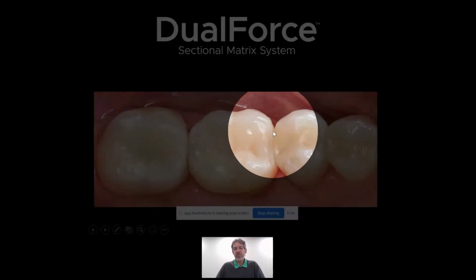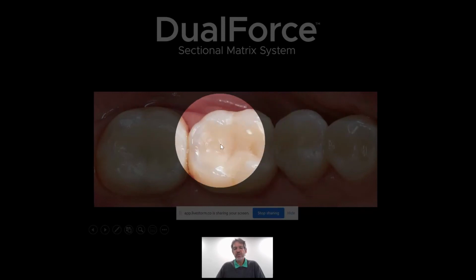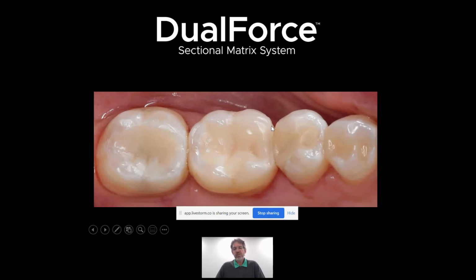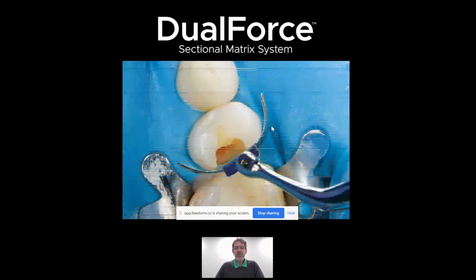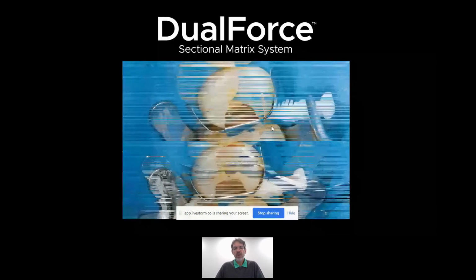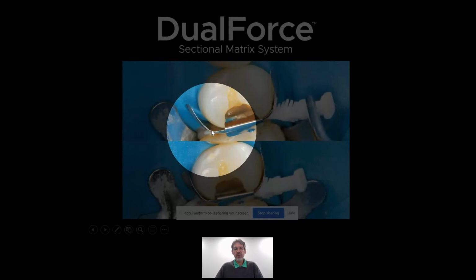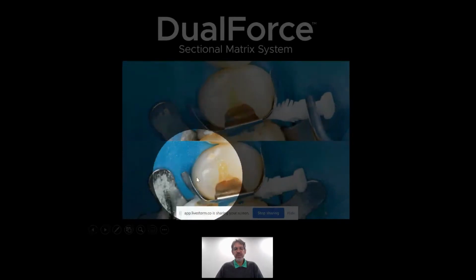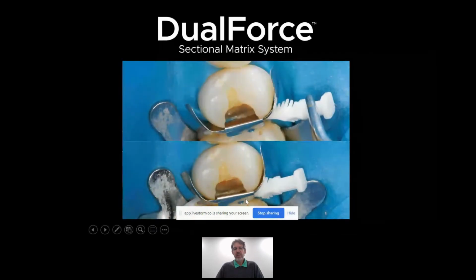But you can see you've got a nice, broad, tight contact, no issues with food impaction, no issues with tooth dislodgement or rotation, or defective occlusal contacts. And then this is just a little premolar. Again, here we use the punch pliers for placement, folding that little tab over, holding it in place. But here you can see how that little tip of this wedge compresses as you push it through the embrasure. But once it's gone through, how it springs back.